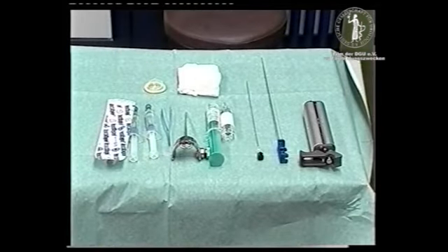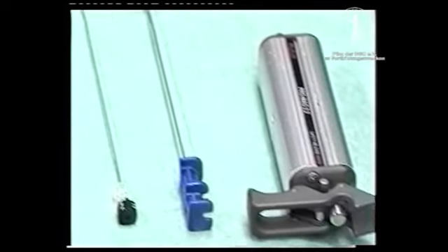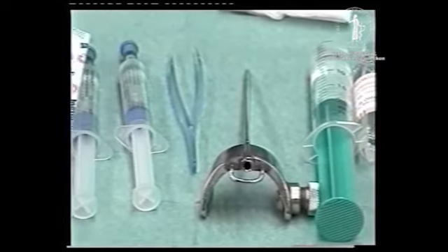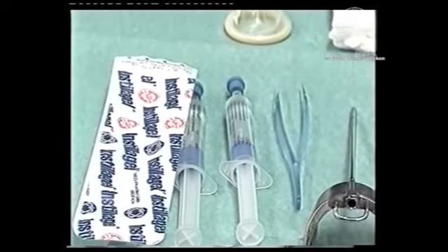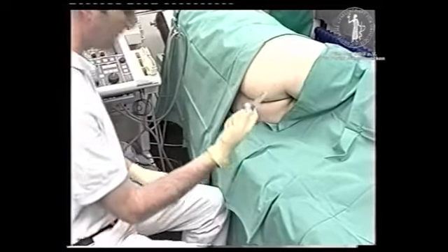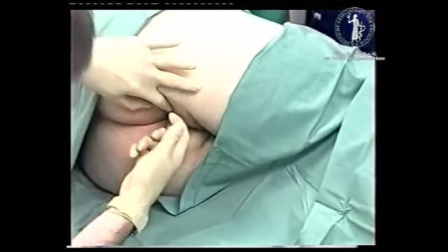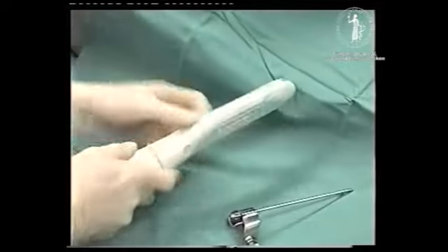Besides the commonly required material for the biopsy procedure, we additionally need a 26-gauge, 25 cm fine needle and 20 milliliters of a local 1% anesthetic. Mucosal anesthesia of the rectum is achieved by application of the lidocaine gel Instillagel, delivered in 6 milliliter syringes. As a first step of the procedure, 6 milliliters of Instillagel are injected into the rectum before preparing the ultrasound probe. We use a side-firing needle guidance from Toshiba for the injection of local anesthetic and controlling the biopsy needle.